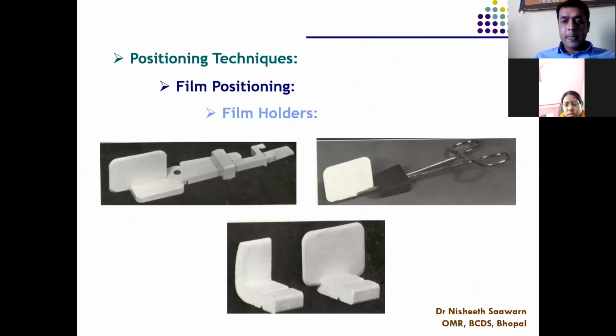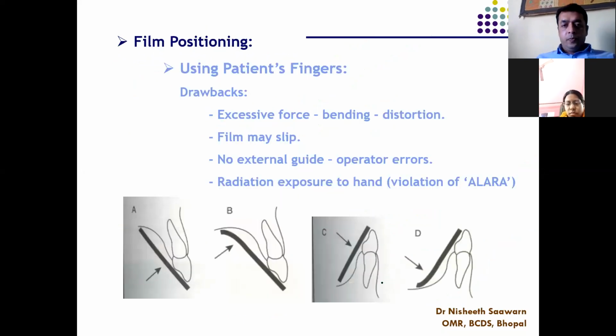Okay, so now, what are the benefits of the bisecting angle technique? It is easy. We don't need any special device.